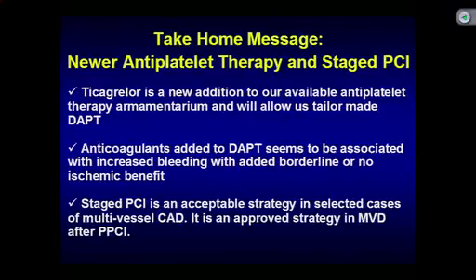Third, staged PCI is an acceptable strategy in selected cases for multivessel CAD. It is an approved strategy in multivessel disease after primary PCI. Very important that the primary PCI should not do multivessel disease PCI at the time. It should be staged. So that's what we basically learned.